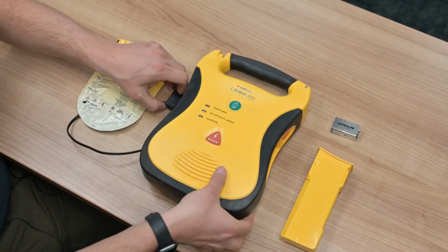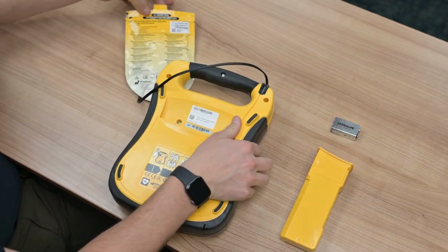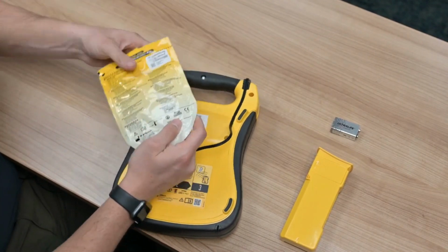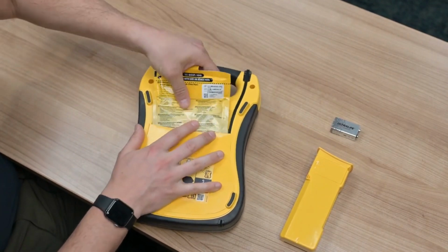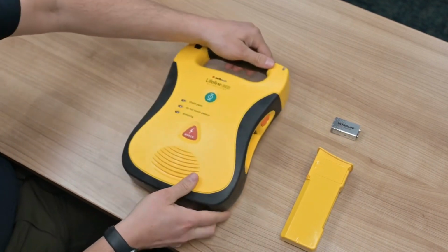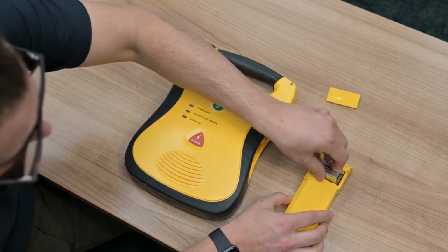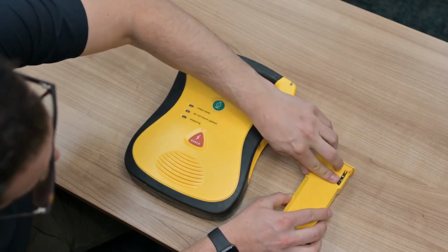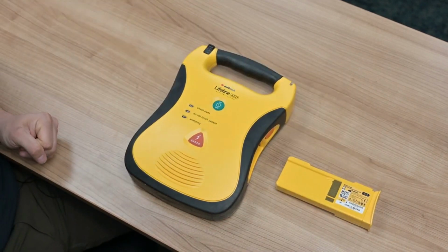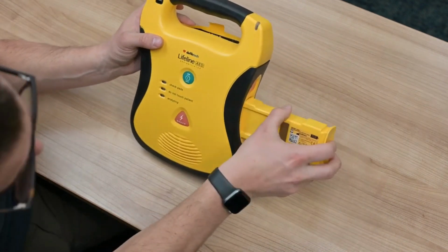Now we're going to show you how to attach your pads and insert your battery pack. It is always important to attach your pads prior to inserting the battery pack. When placing the pads, it is important to have the expiration date facing you so it is easily accessible. Once the pads are attached, you can take your 9-volt battery and place it inside the battery pack. Once the 9-volt battery is inside the battery pack, you can insert the battery pack into the side of the AED. Make sure the label is facing you.